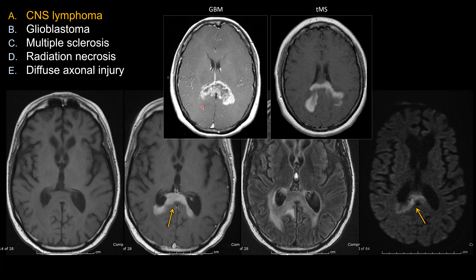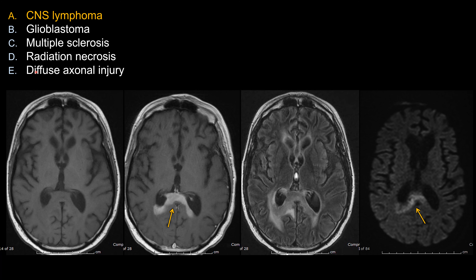For radiation necrosis, it can mimic high-grade glioma and should also look like something with a lot of central necrosis, not homogeneous enhancement. For diffuse axonal injury, even though the patient has a history of recent trauma, I would expect to see other DAI lesions scattered throughout different locations, not just a solitary lesion across the corpus callosum. Even though this is a location DAI commonly involves and does show restricted diffusion, you would expect much more evidence of other lesions compared to just a single lesion. So choice A remains the best answer.